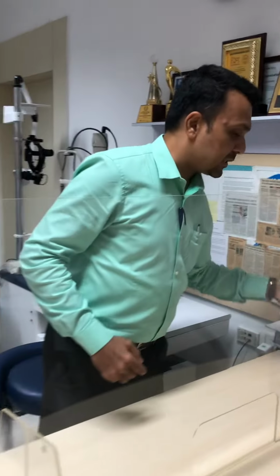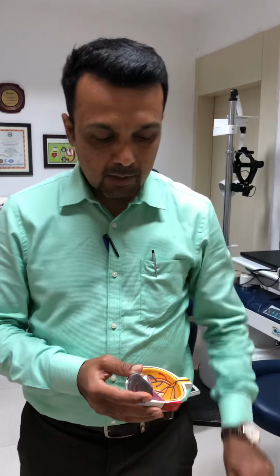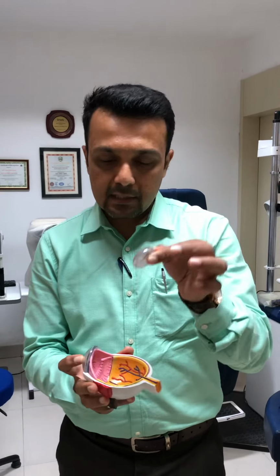Now just in short, I'll be telling you, this is the eye of the patient. It has 3 parts. The outer part is called the cornea. This is the cornea, and this is the lens, and the back is the retina. So this is the eye of the patient. This is the cross section.